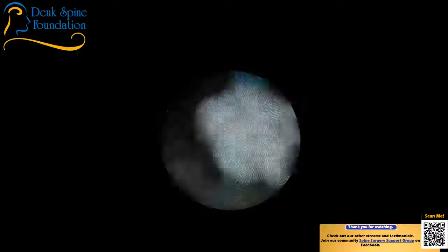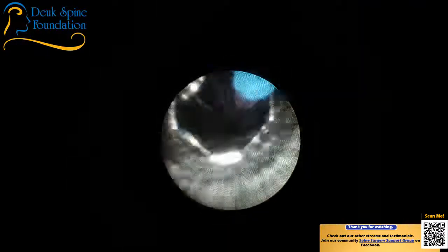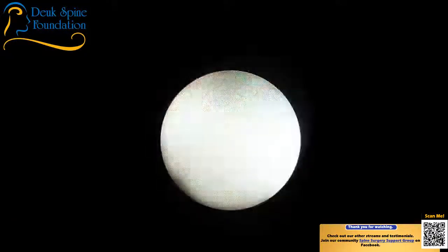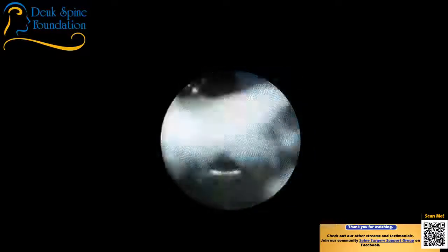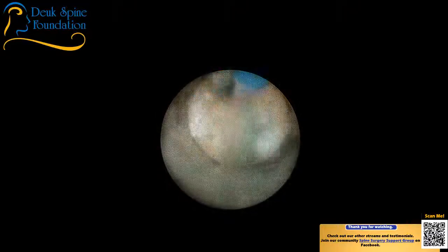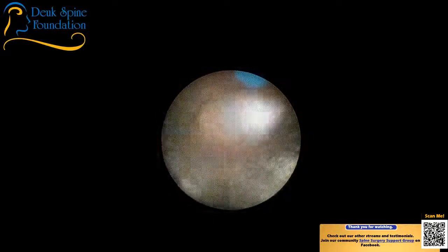What about taking post-op pictures for fusions? It's perfect. You can get cervical, lumbar. The machine itself is smaller than the one we had. Is it a digital plate? It is wireless. All right.